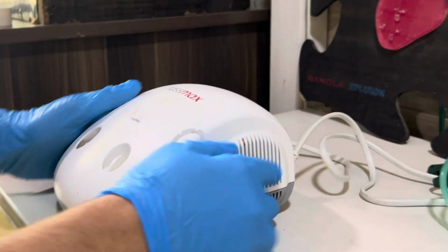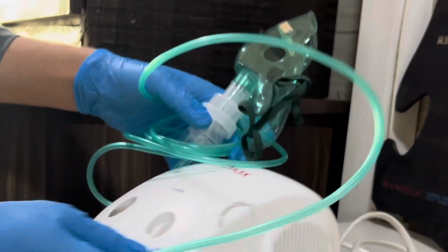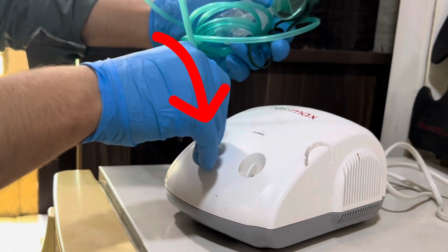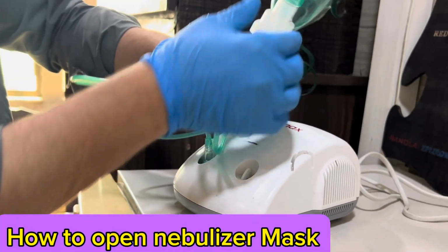After that, you see this is a nebulizer mask. We have different types of masks, like the oxygen mask, but this one is a nebulizer mask. Here we can attach the nebulizer mask extension with the machine. Here you should attach the nebulizer mask tube to the nebulizer machine.